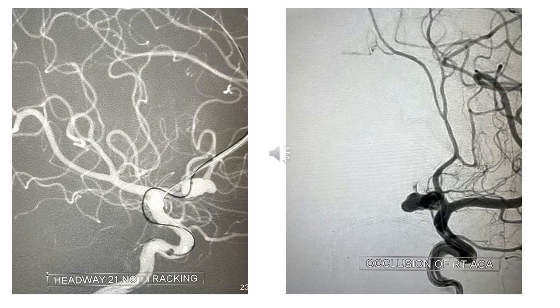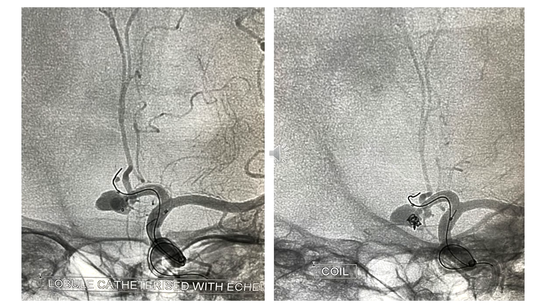And the Headway 21 did not track, like Headway Duo and also like the Echelon. So the Echelon got a little bit further, but not completely distal. So I checked with the DSA. You could see now that the ACA has got occluded here. It was worrisome now for me.